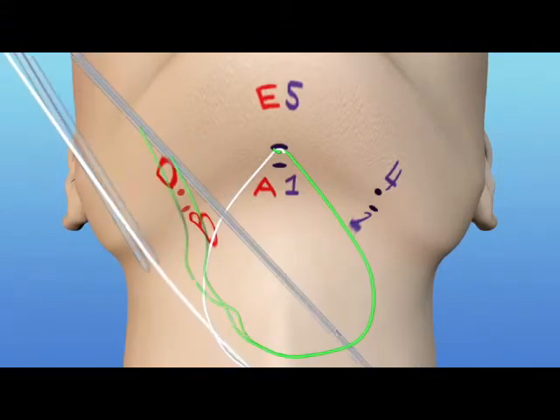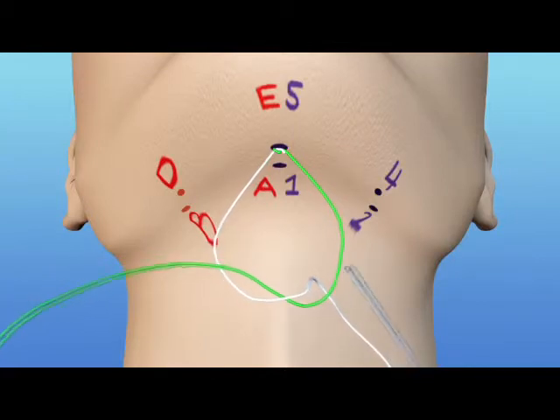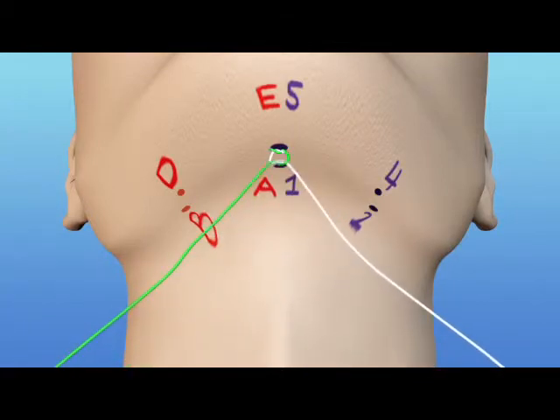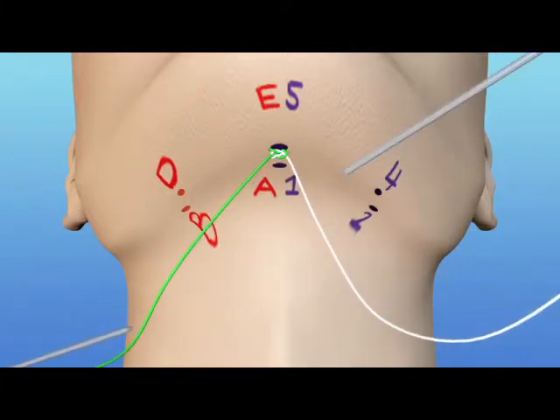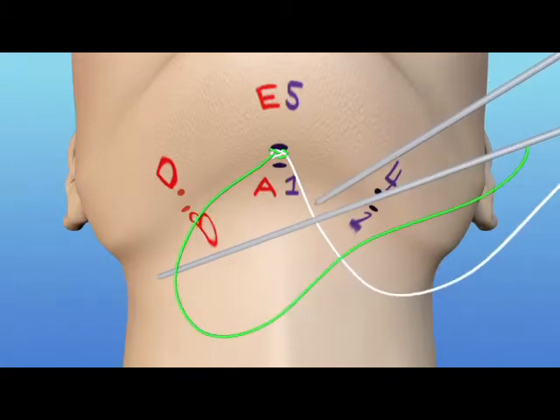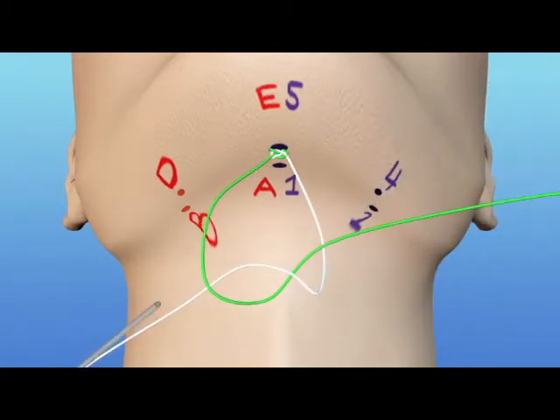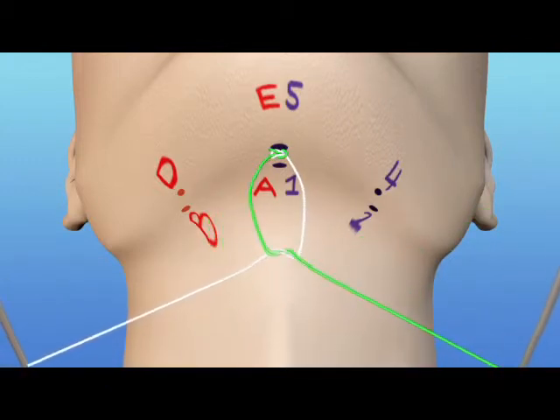The first throw can either be a surgeon's knot double throw or just a single throw in a square knot, as in this application that you are seeing right now. I always throw another throw so that I have 3 throws of the knot to further secure the knot in this region prior to completing the remainder of the procedure by proceeding anteriorly and placing the trampoline platysmoplasty.